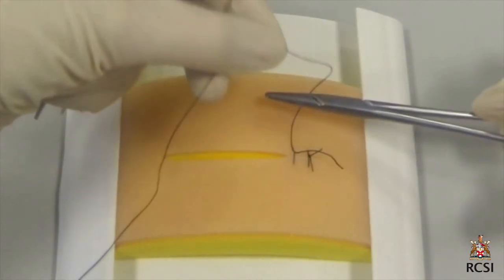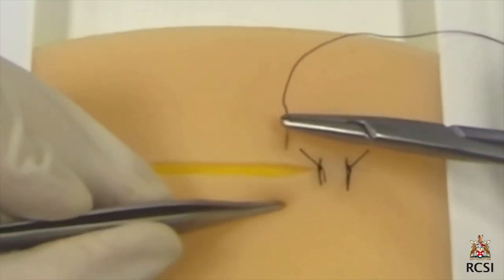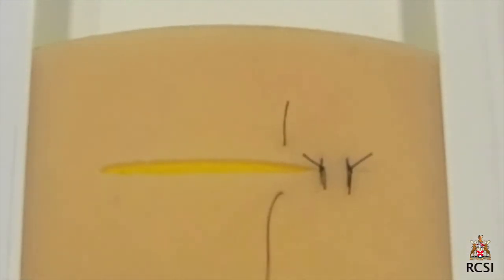Once the surgeon's knot is performed, the knot is again locked. Once locked, the short end is gently brought back to the side near the surgeon and a reef knot is then performed. This is important because if the short end is left after locking it to be away from the surgeon, you will end up with a slip knot.